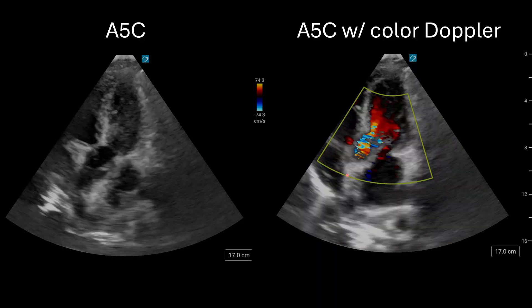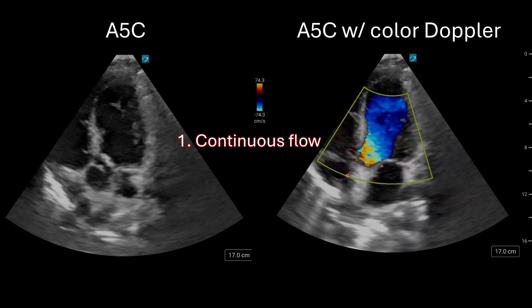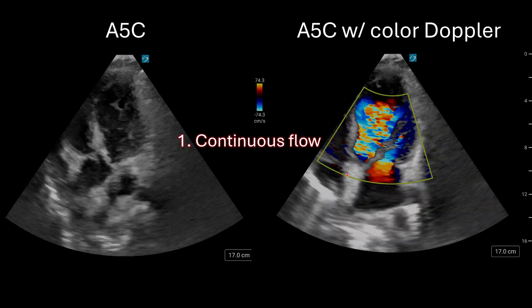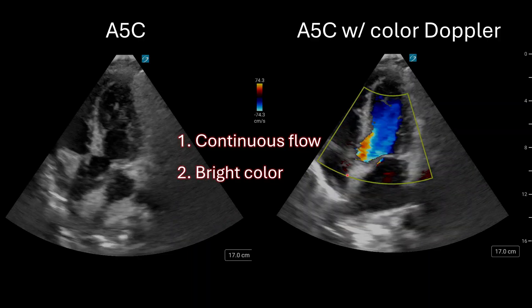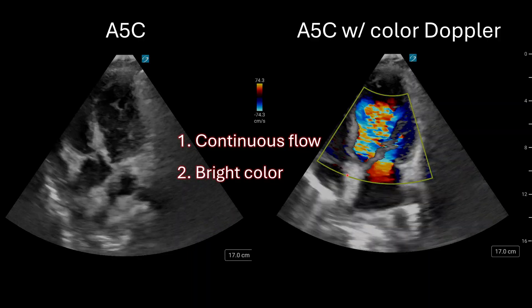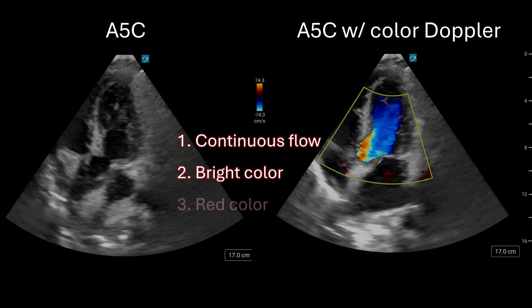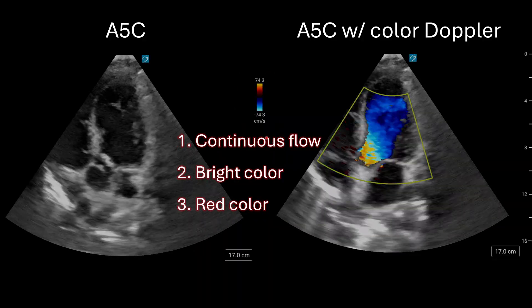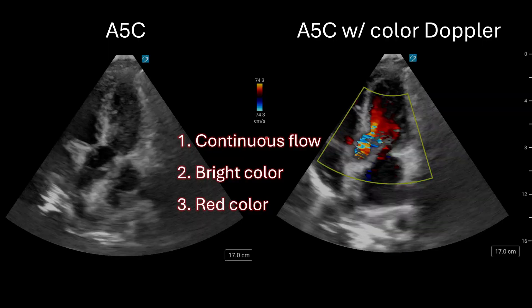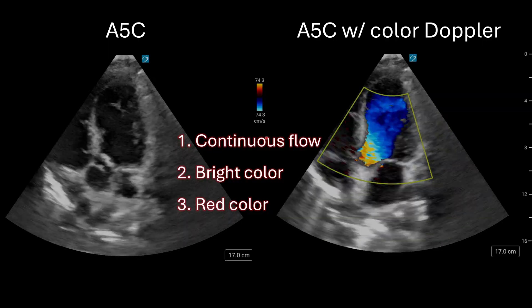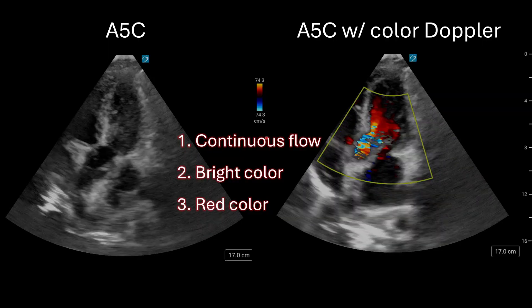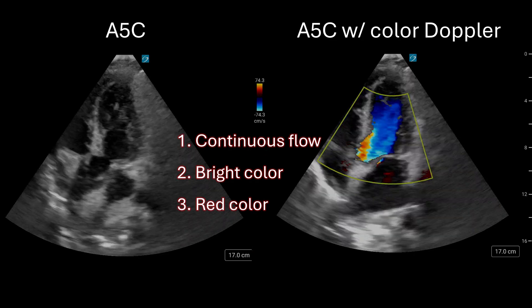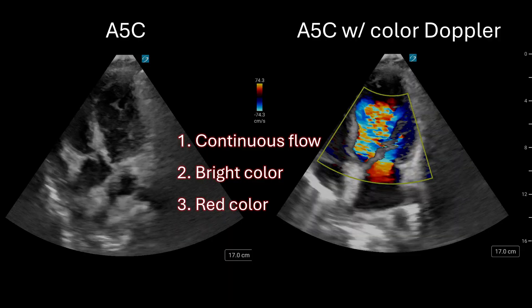On the color Doppler, there's a large regurgitation jet. How do I know this is regurgitation? Three reasons. First, I see continuous flow in the LVOT — there should be no flow in the LVOT in diastole. Second, the jet is bright, meaning fast and usually turbulent blood flow. Third, the jet is red. Based on the color scale, a red signal is blood moving towards the probe, but blood flow should be going away from the probe in the LVOT and appear blue. So this is acute severe aortic regurgitation due to endocarditis causing a flail leaflet of the aortic valve.